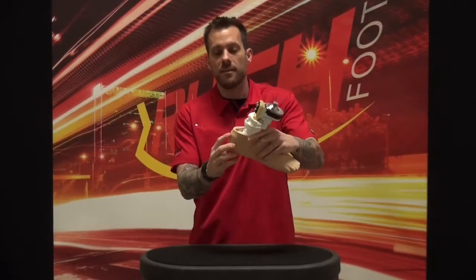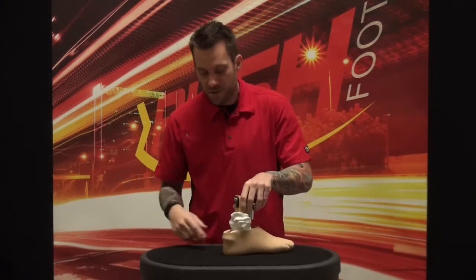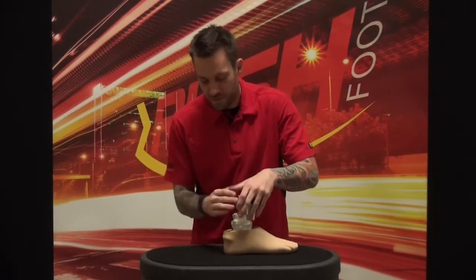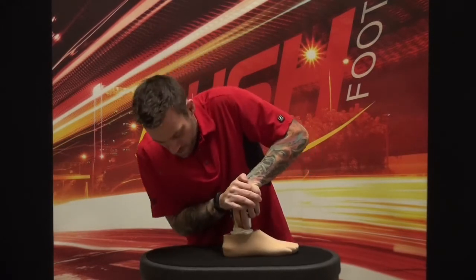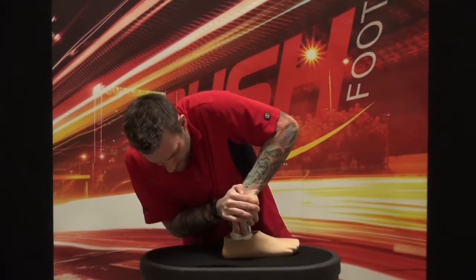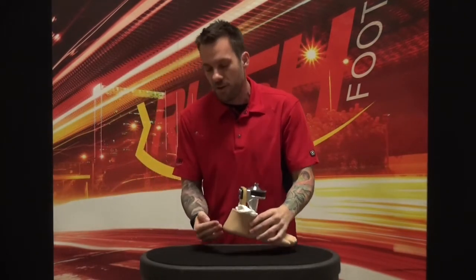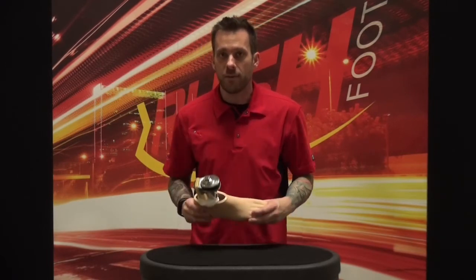Now you can see that the heel section has cleared the trim line, and so from here all you have to do is get some leverage, attach a pylon if you need to, but a little bit of downward pressure will help it slide down underneath that lip and engage it, and it'll hold it in place. Listen for the pop, that's when you know you're there. Voila! It has now dropped all the way down, and that lip has bit right over the top of the heel section, and now it's on and it's not going to go anywhere.